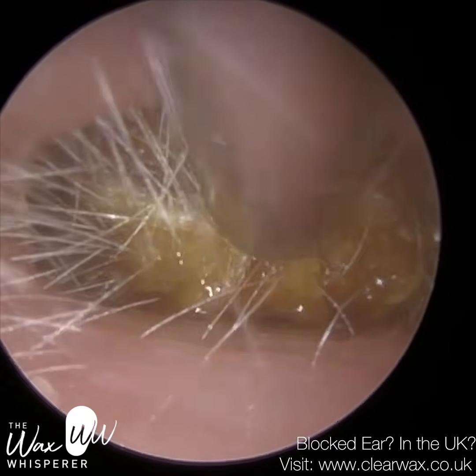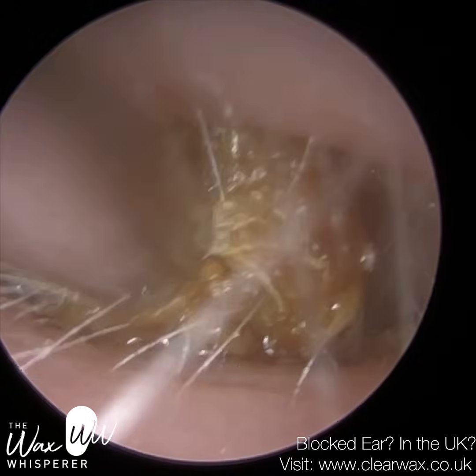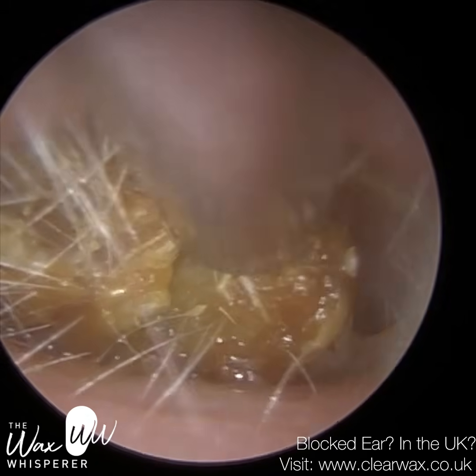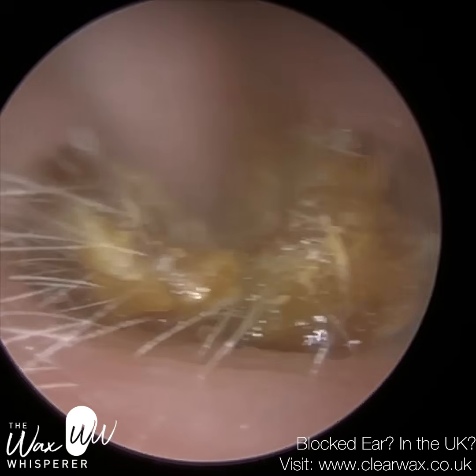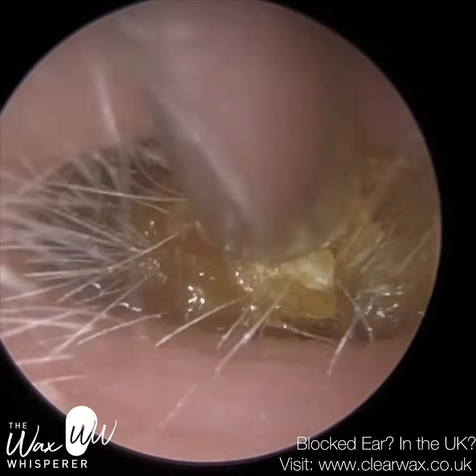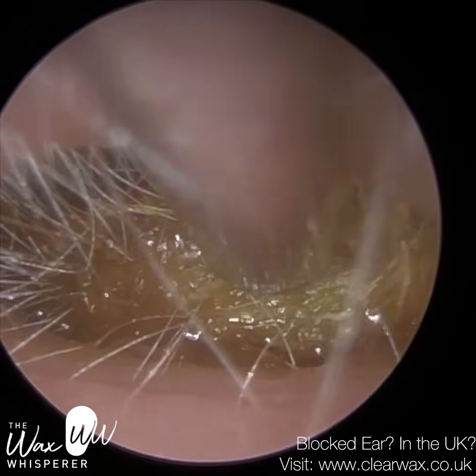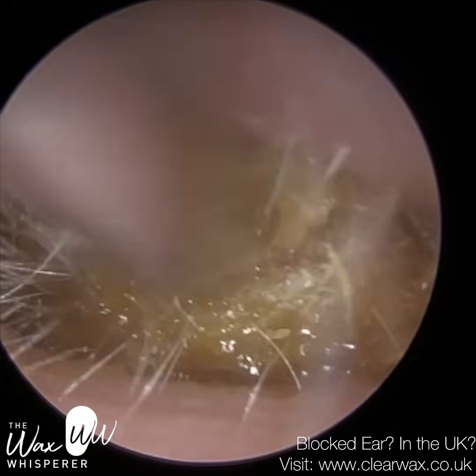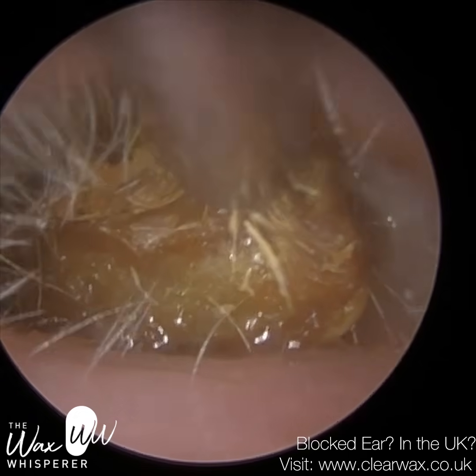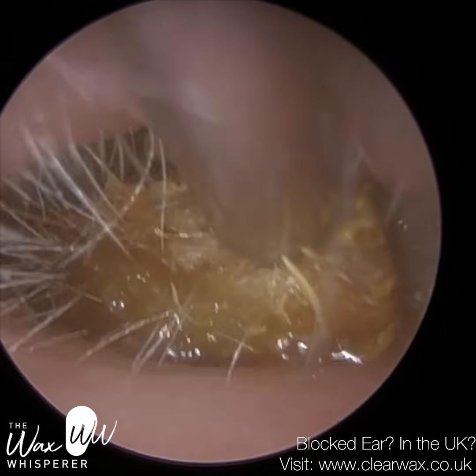So the skin that lines the ear canal is different on different sections of the ear canal. On the outer third, the cartilage portion, where we are now actually, the skin here is about 1 millimeter in thickness, and it contains three layers. You've got the epidermis layer, which is the outer protective barrier of skin, and that's about 0.2 millimeters in thickness, there or thereabouts. Underneath that, you've got the dermis layer, the midsection, and that's where you find the hair follicles, which you can see these hair strands protruding outwards from the dermis layer on the cartilage portion of the ear canal.